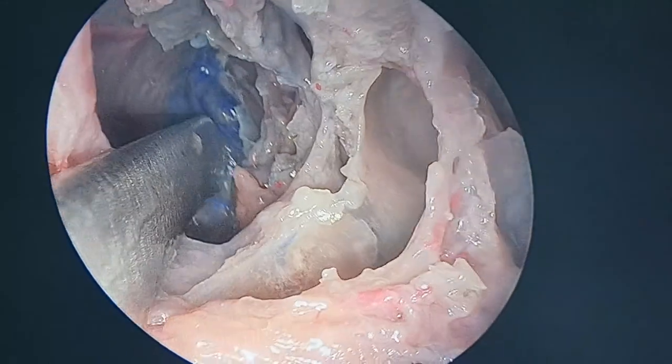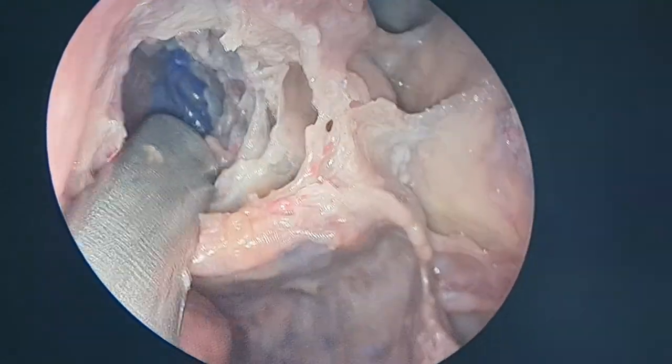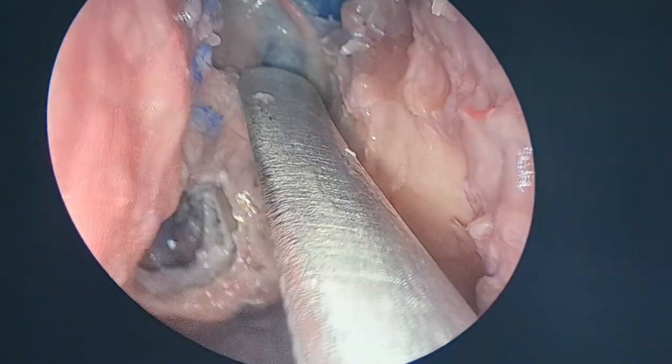Yes. Now how to enter into the sphenoid, where to? This maxillary line, this is the beauty, again I call it a life-saving line. The reason being, like I said, where to make the entry into the ground lamella? At the level of the maxillary line, so that we don't penetrate the skull base. Same here.